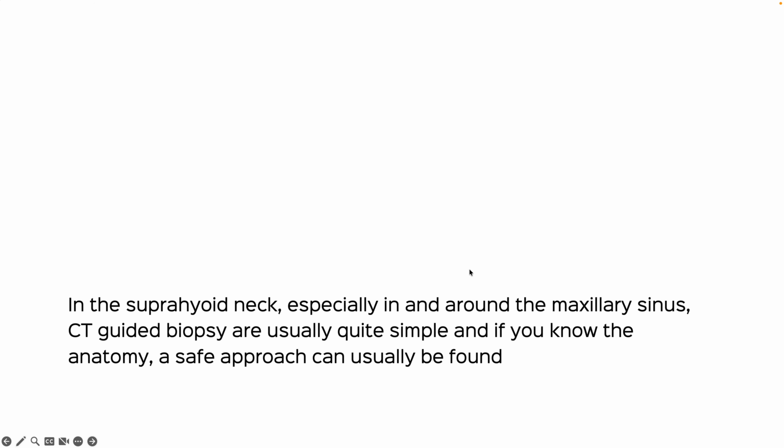But in the suprahyoid neck, typically in most of the spaces, if you know the anatomy and you know the safe approach avoiding vessels and nerves, you usually can get a needle inside. So it's just something that we need to remember.